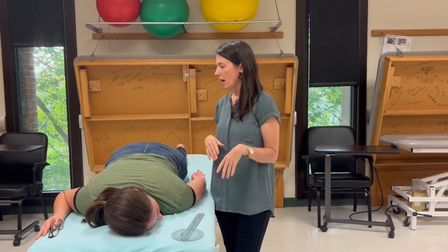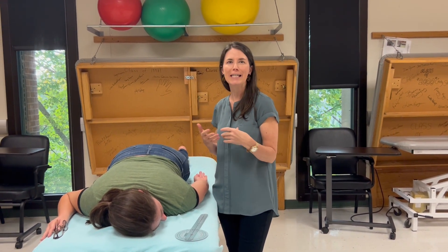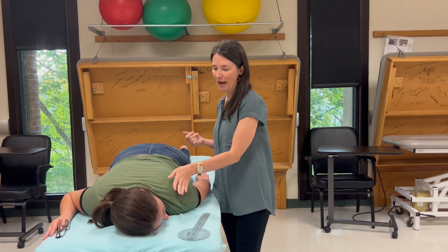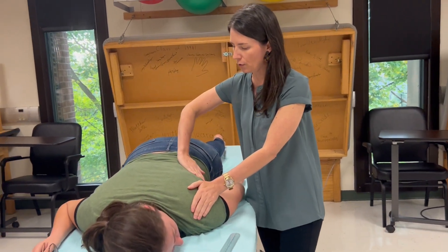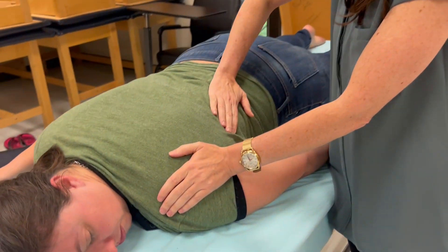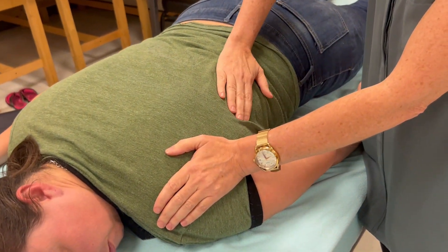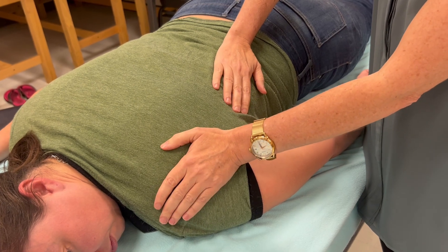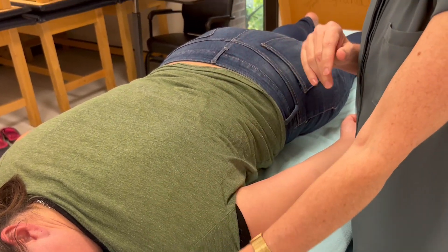If you're in a situation where you do need to palpate, you should know what you're palpating. You're going to palpate the posterior shoulder and also just inferior to the inferior angle along here, because we're trying to catch the lats and posterior deltoid when differentiating between a grade 1 and a grade 0.